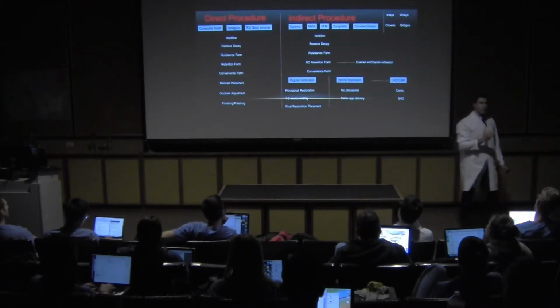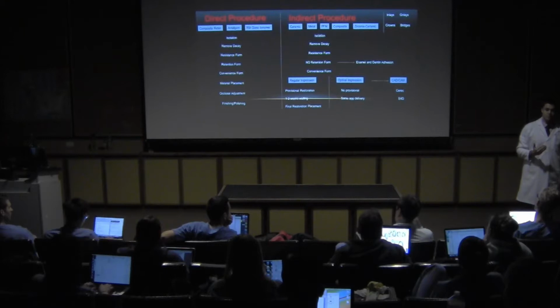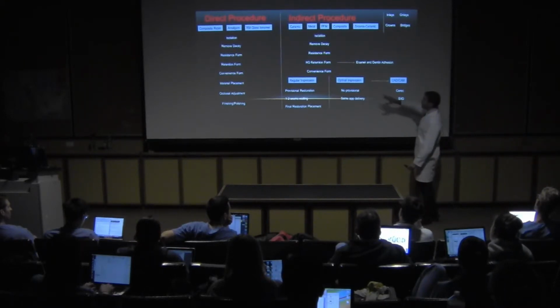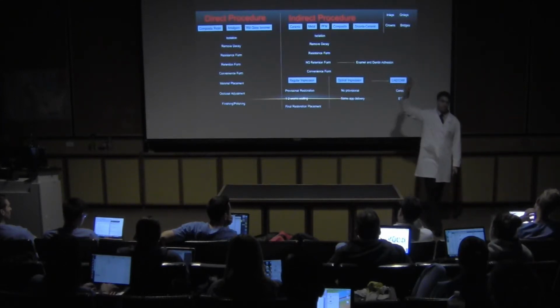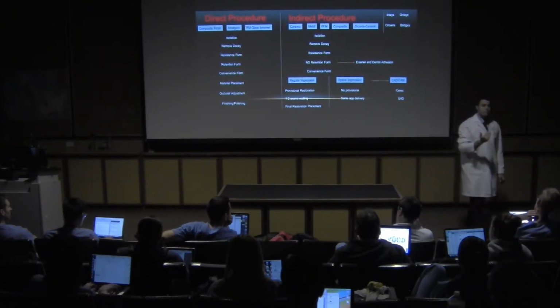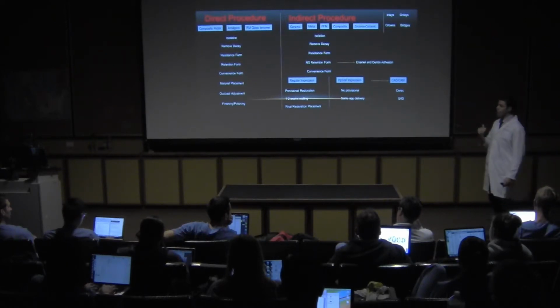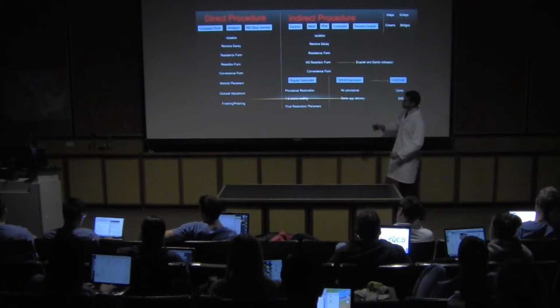And the retention form, I don't have a retention form for indirect procedures. Okay? Because in indirect procedures, I will have the retention through enamel and dentin adhesion. Okay? Through a cementing process. It's different from what we have had until now. And I'm going to do the convenience form.